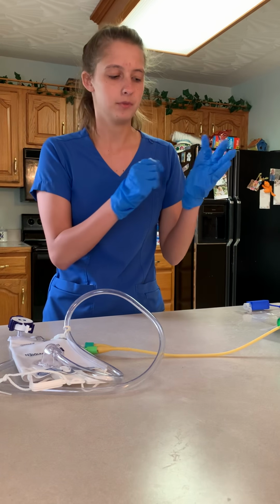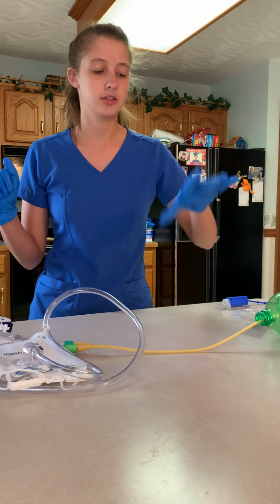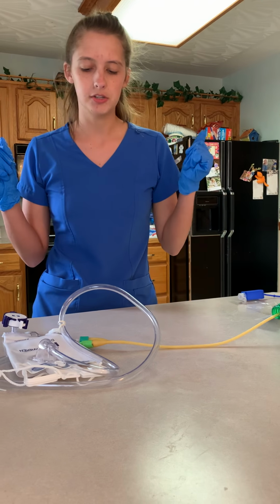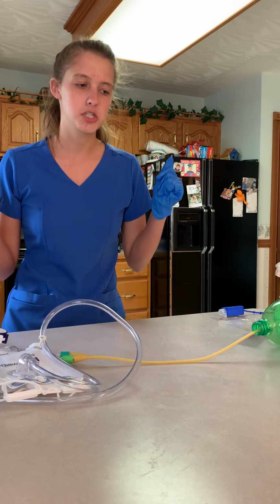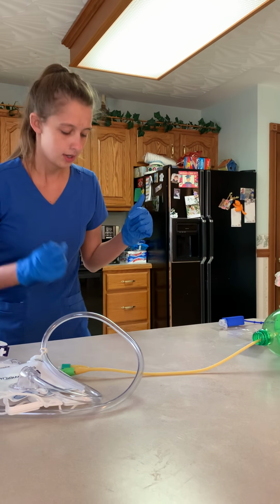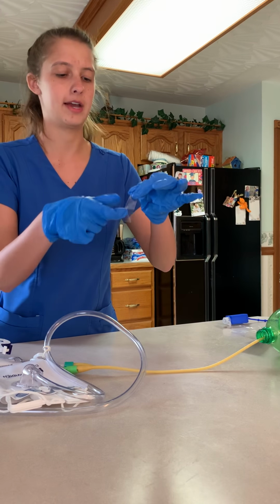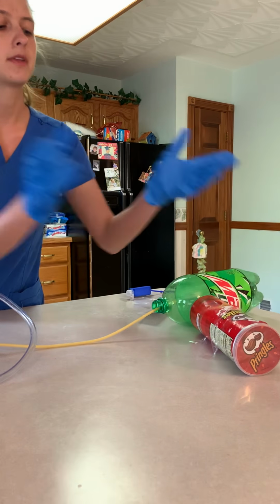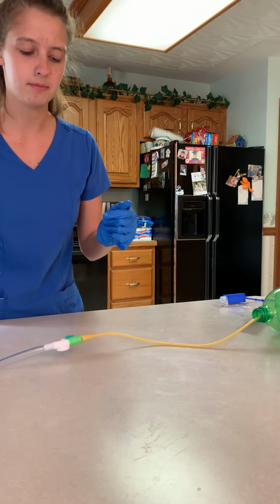And now that we have done the peri-care, I can now return the foreskin back to its original position. And now what I'm going to do is tape the catheter onto the patient's leg. And when we do this, I'm first going to put down one piece of tape to the patient's leg so that there is no skin breakdown. So there's my first piece of tape. Okay, and then next I'm going to get that ready to tape.